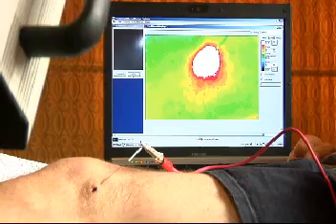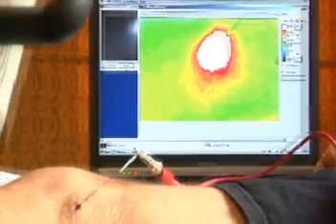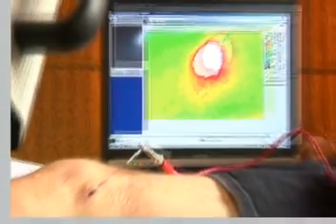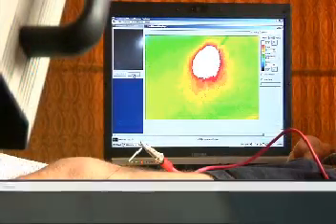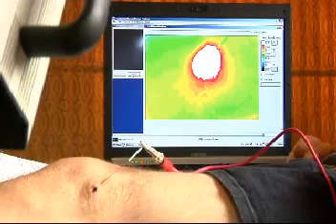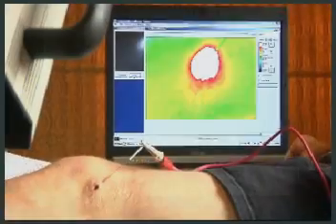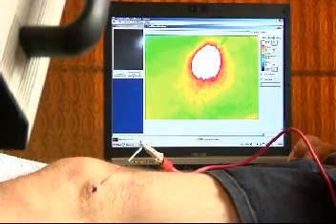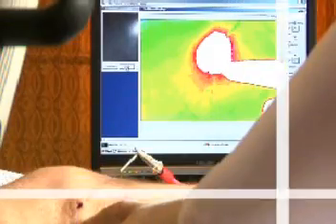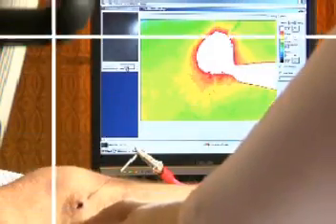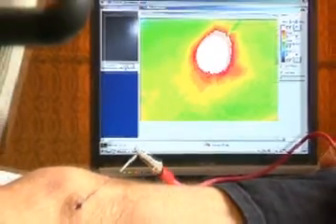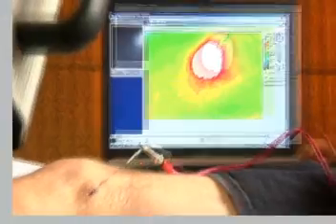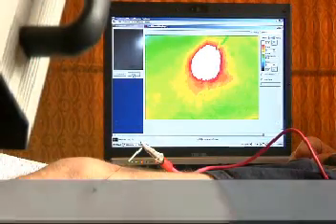It's cycling up. As far as I know the camera's showing that you're getting the margins you need. Because it's not only going out, it's going down because I've got the needle in near the bottom of the tumor. So actually we've gone a little bit beyond the edge. That's the way I do the breast. I just take a marker and mark it. We know we've got it.